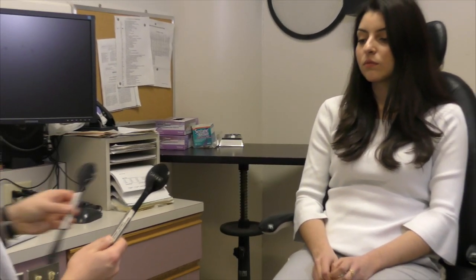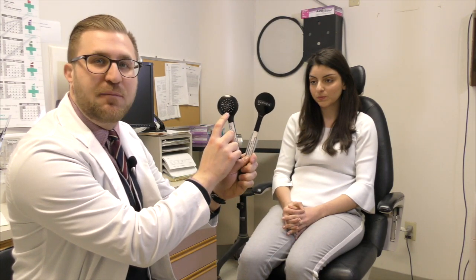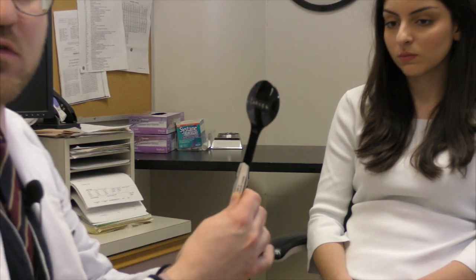Let me show you the occluders. There are two types used for the ophthalmic visual acuity assessment: one is a solid occluder, and one has small holes in it — this is for your pinhole test, which we'll describe later. You have the patient hold the occluder up to their eye using the same hand: if checking the right eye, use the right hand. Cover on top of the glasses and make sure they cover very well while looking through the other eye. I like to start with the right eye by default.